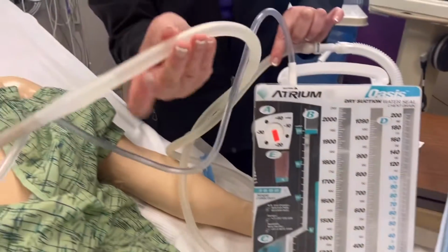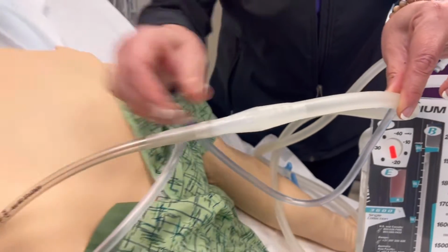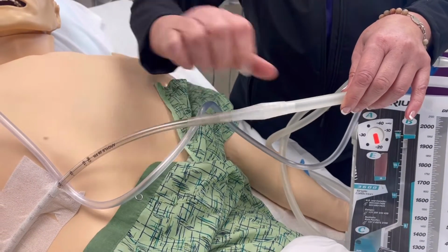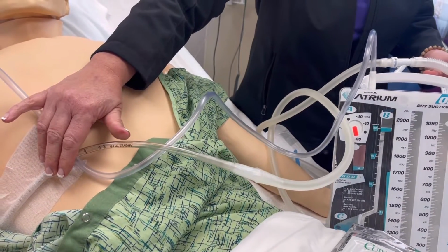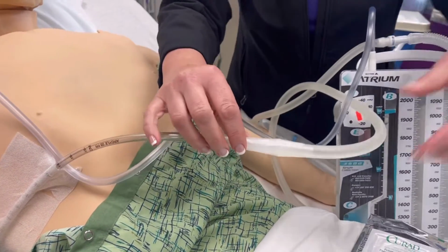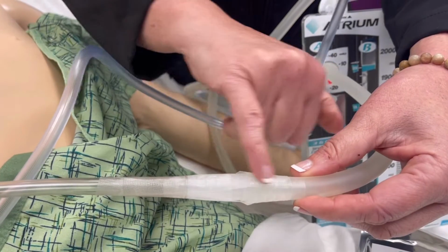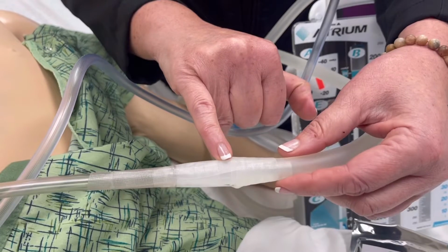end of the chest tube collection tubing. This is the chest tube itself. These are disconnected. The tip of this is sterile, and this is what you will hold out for the provider to connect into. These are always sutured in place. And when the provider is done and we've connected, the provider will place clear tape vertically on both sides, and this allows us to evaluate at the connection if there is an occlusion, perhaps with a blood clot.